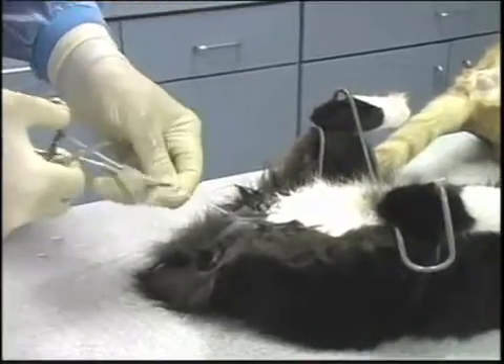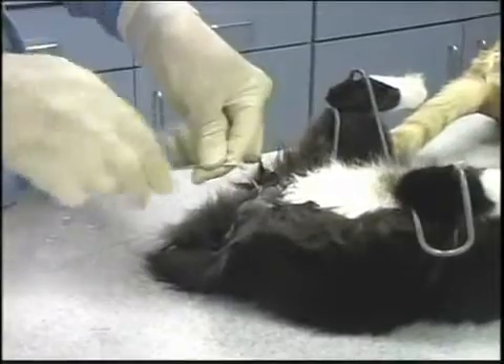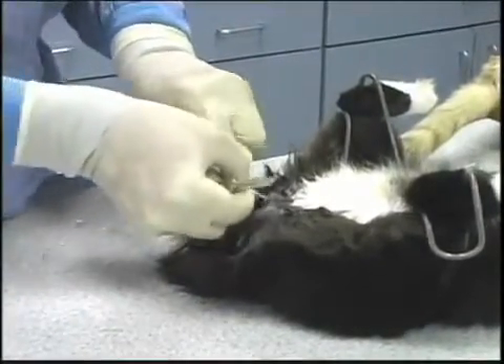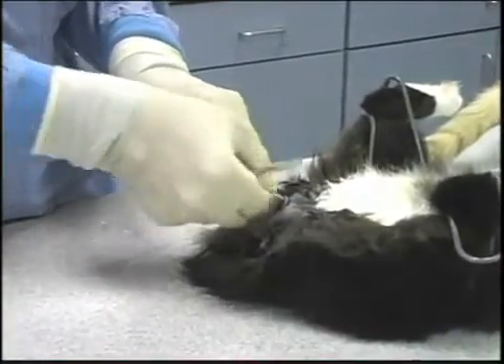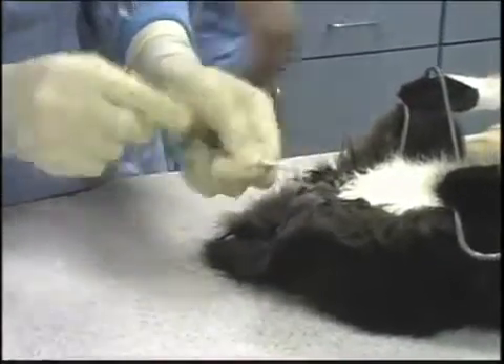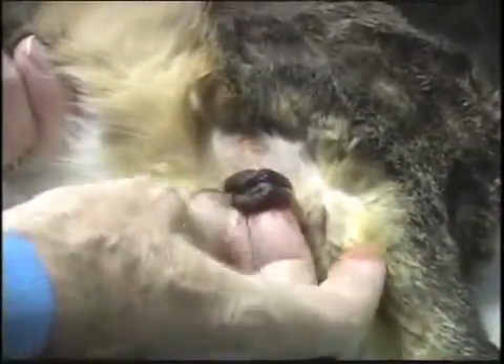Always clean the cord nicely so that you don't have extraneous material in there when it comes off the end of the instrument. To get that off, you need to loosen it — you can't hold back here tight and push it over the edge. You need to loosen it up and then do the cinch. On male cats, you don't have to put in a suture. They'll just collapse and fold in on themselves and the kitties don't bother them.